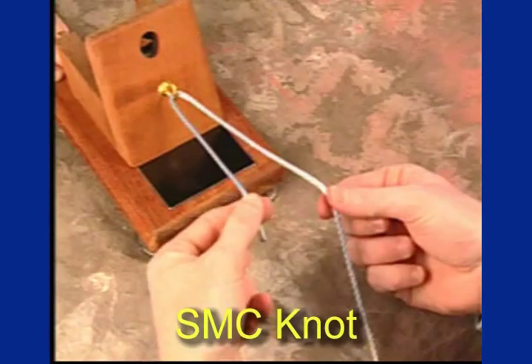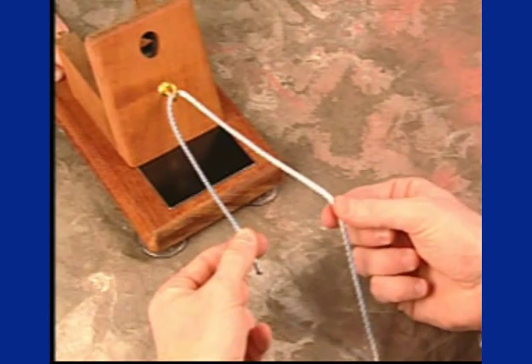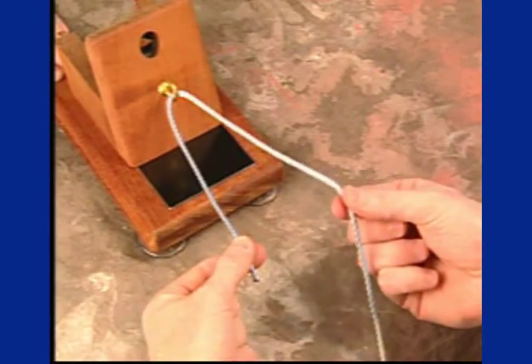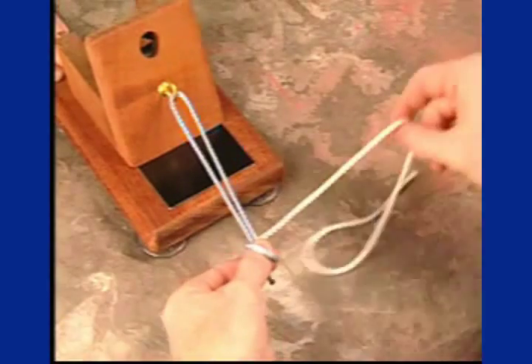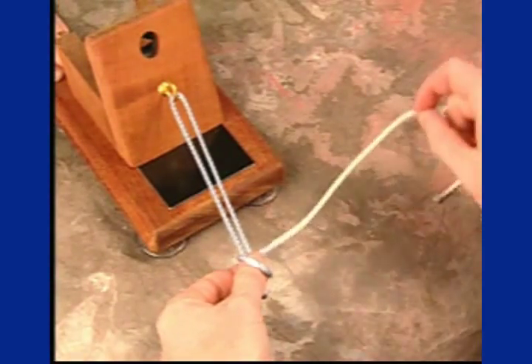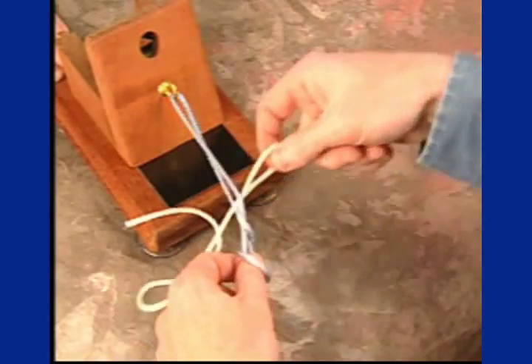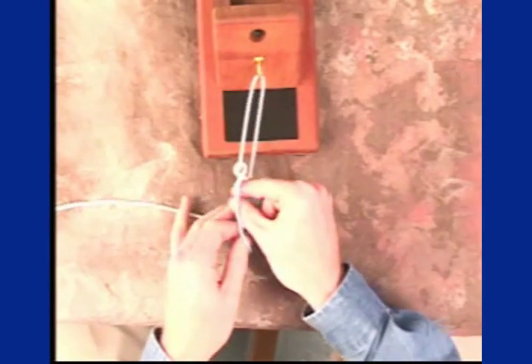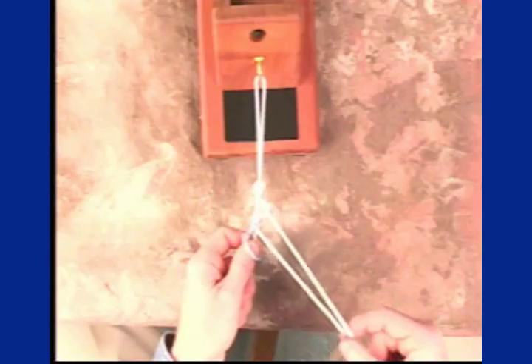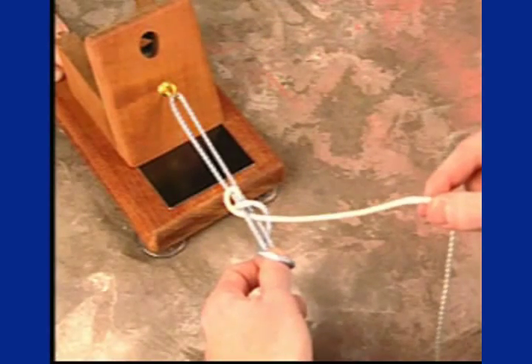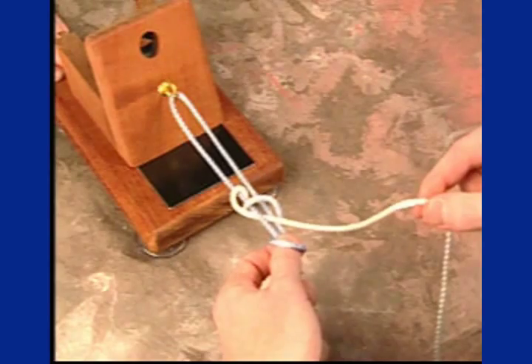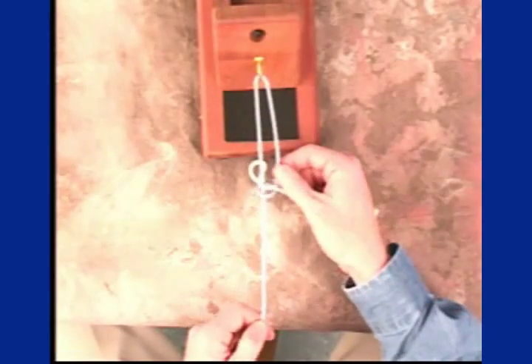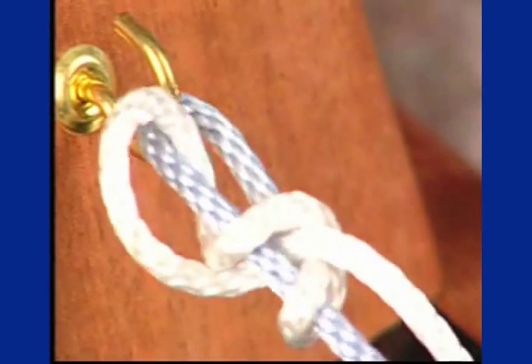This is a demonstration of the SMC knot, named for the Seoul Medical Center. The post limb is one half the length of the loop limb. Initially, both sutures are pinched between the index finger and thumb, and an initial loop made over the thumb and both sutures. A second throw is placed just around the post limb. The loop limb is then brought up through the loop made by the loop limb, initially around both the post and the loop limb. Without tensioning this knot on the post, the knot is slid into the joint and subsequently tightens against the soft tissues.